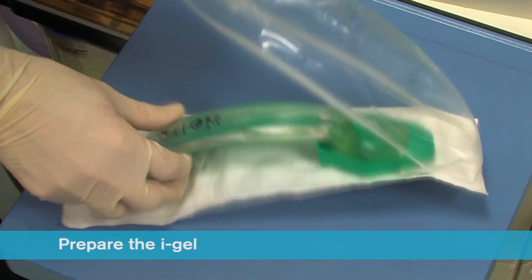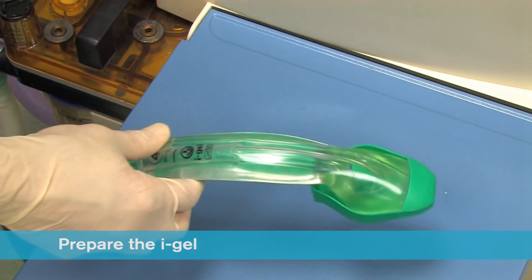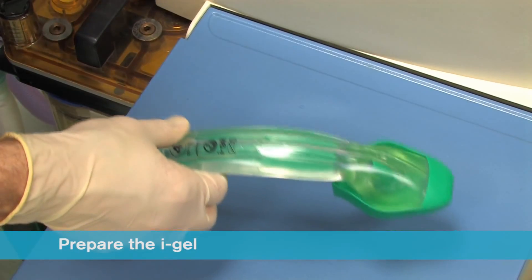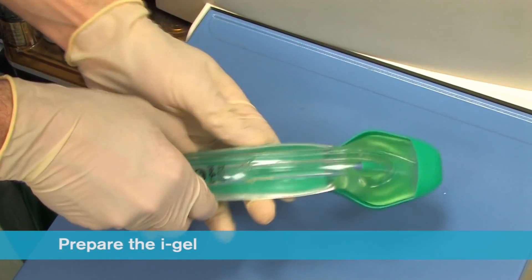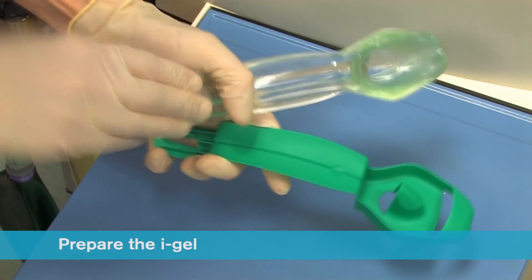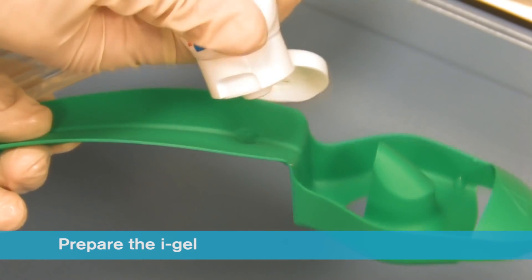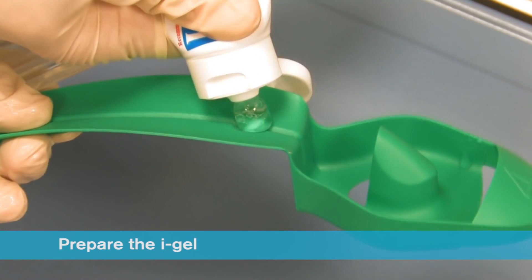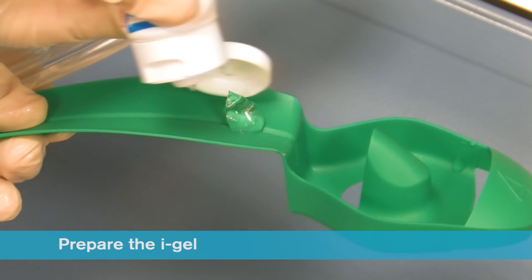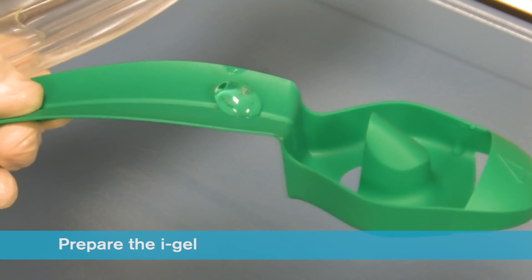Ensuring that you conform to local policy for hygiene, open the iGel package and on a flat surface take out the protective cradle or cage pack containing the device. In the final minute of pre-oxygenation, remove the iGel and place a small bolus of a water-based lubricant such as KY Jelly onto the middle of the smooth surface of the cradle or cage pack in preparation for lubrication. Do not use silicone based lubricants.